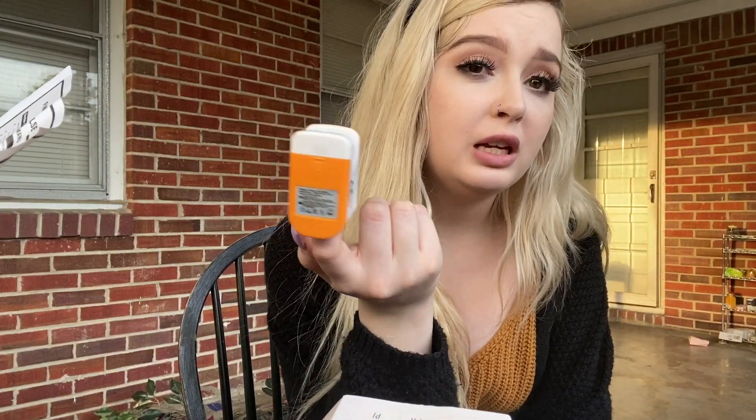Make sure that you store your oximeter in a clean, dry place. Water or any kind of moisture at all can definitely damage this little bad boy.